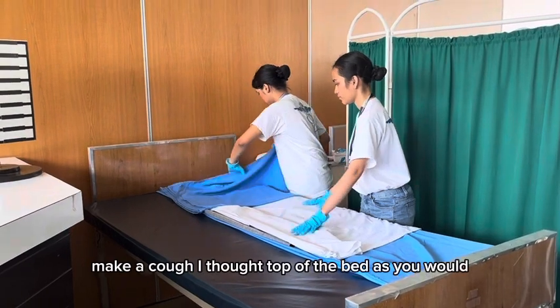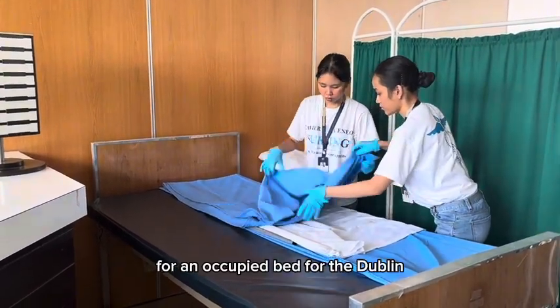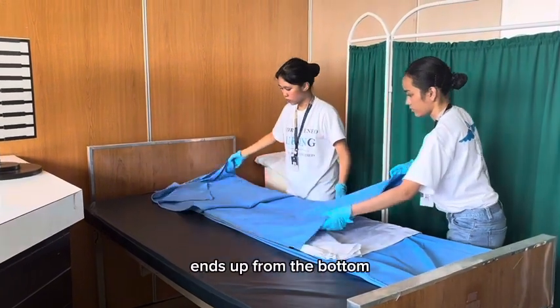Make a cuff at the top of the bed as you would for an occupied bed. Fold the top linens up from the bottom.